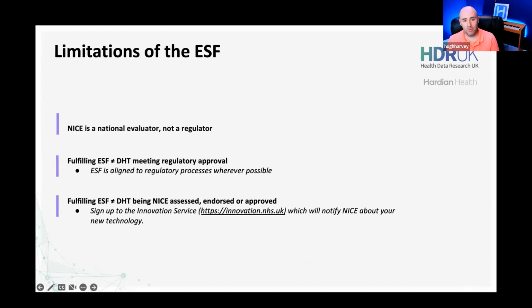And also, if you fulfill the evidence standards framework, it doesn't mean you have been assessed by NICE or endorsed or approved. To do that, you have to do a formal health technology assessment. So you can sign up to the innovation service through this link, which notifies NICE that your technology exists. And then once you are in their system, you then might want to apply for an HTA assessment at some point.